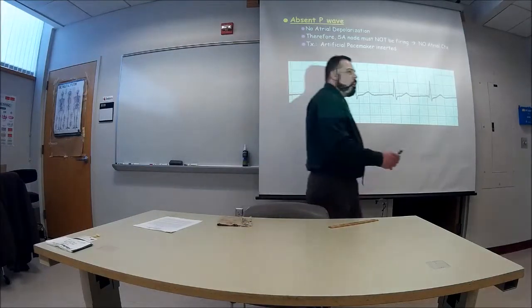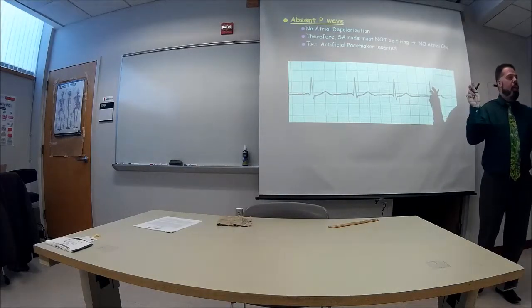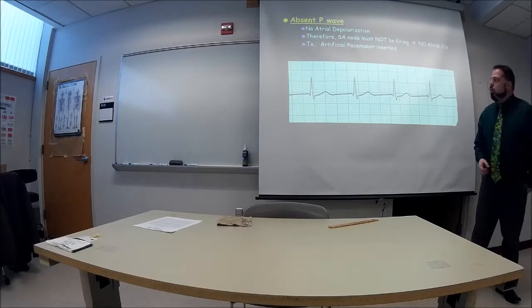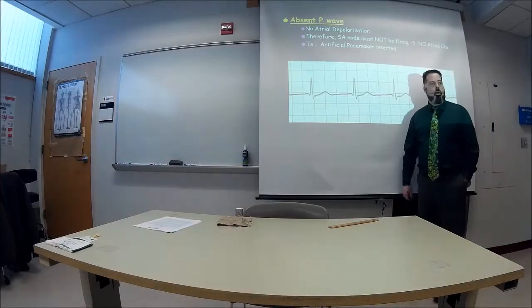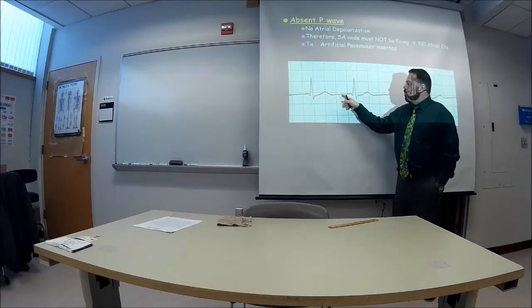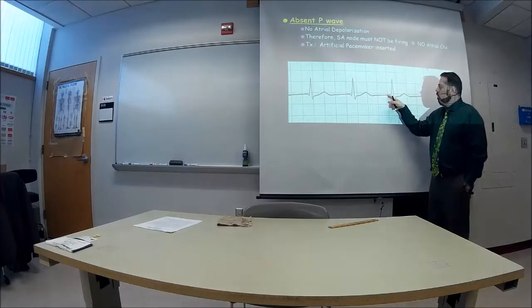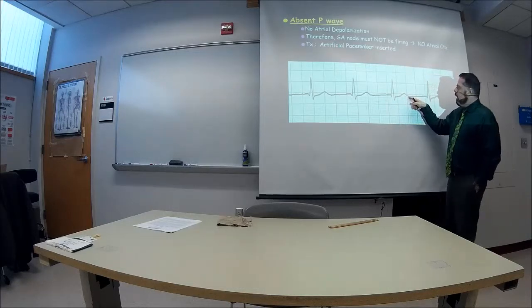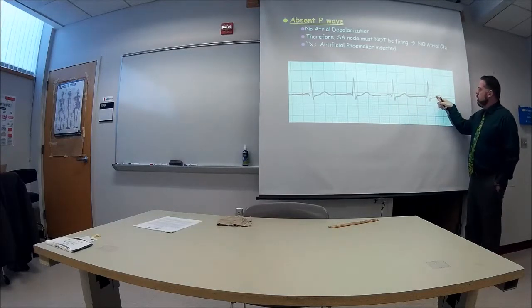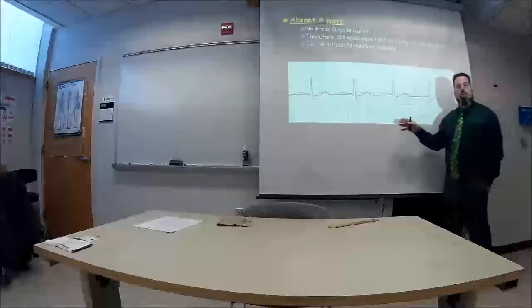Now, keep in mind what the P wave does. The P wave is when the SA node, known as the pacemaker, fires. So you could have a situation here where there is no P wave. See, that's a T wave from that, but there's no P. But you have a QRS complex, a T, QRS complex, a T, QRS complex, a T. Their heart rate will go slower.